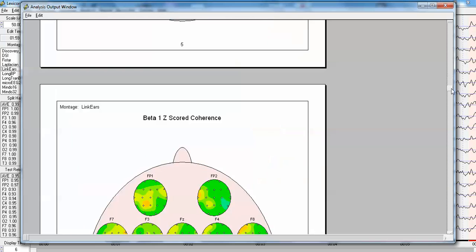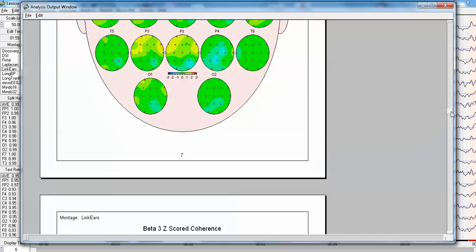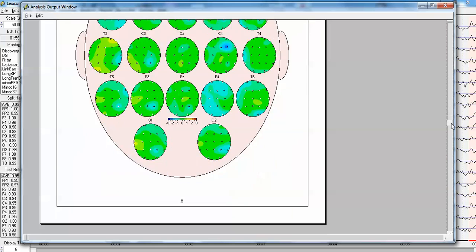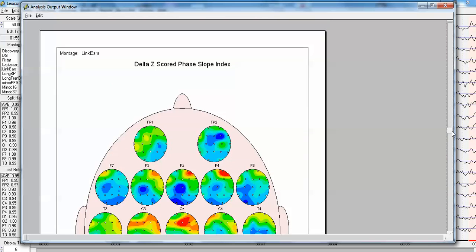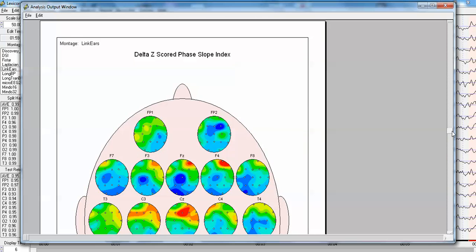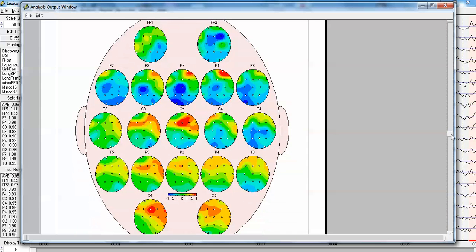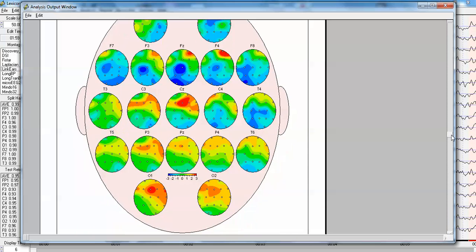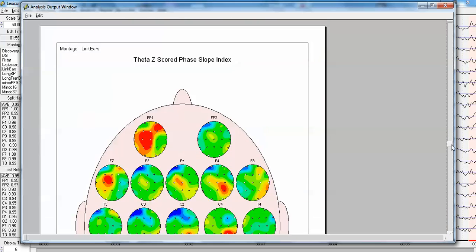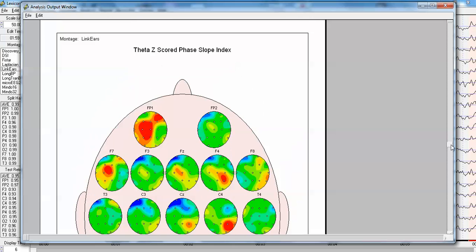And next, we're going to take a look at the phase slope index to see the kind of information the phase slope index provides as complementary to the coherence.